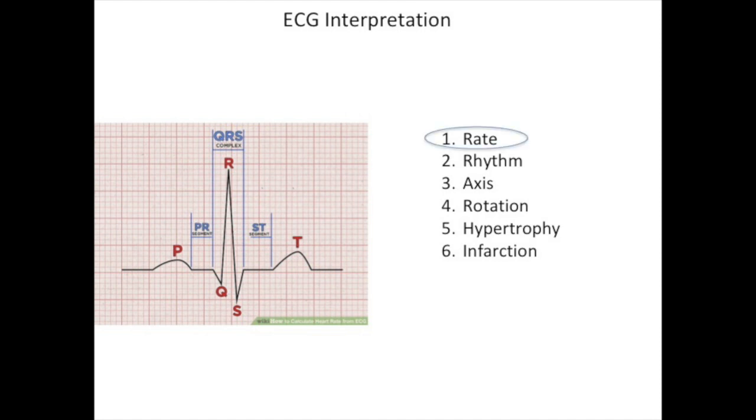Okay, and you guys have at least done this yourselves at one time, and it's really determining the heart rate, and it's useful to help identify if there are any abnormalities that exist in the categories that we will further evaluate. And when you interpret rate, we use lead 2 on your ECG tracing.